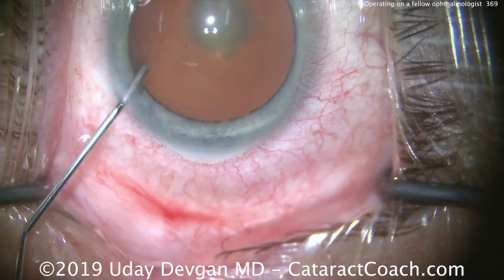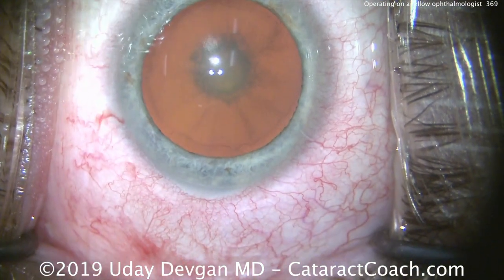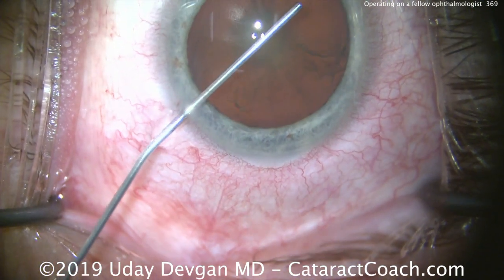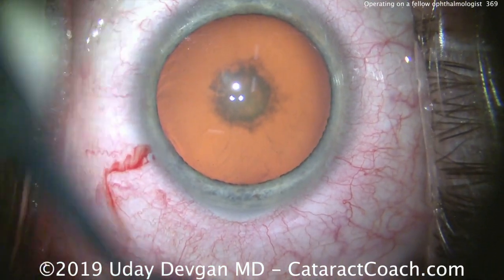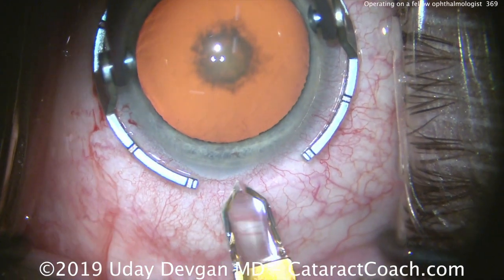So I start off by putting in preservative-free lidocaine. This is 1% lidocaine preservative-free, but 50-50 with balanced salt solution, so it ends up being 0.5%. Here's the dispersive viscoelastic, Viscoat in this eye, getting a nice good wave and a good coating of that endothelium. I like diamond blades a lot. And so here's the diamond.